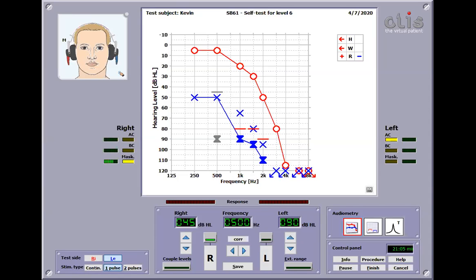Okay. First 10 dB plateau, nothing. We keep increasing the signal level. First 10 dB plateau, second 10 dB plateau. Please respond. Oh, okay. So there's nothing. We go back to 25 dB plateau. Still nothing. Oh, there's something. Okay. And we do 30 dB plateau, please?